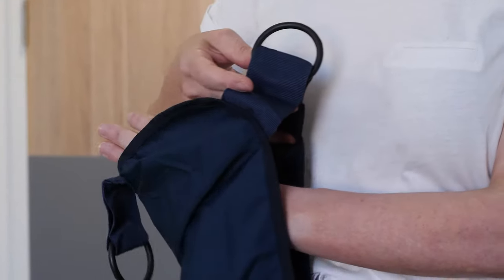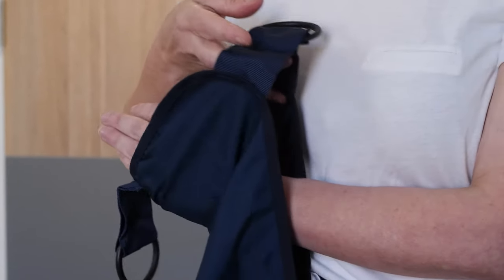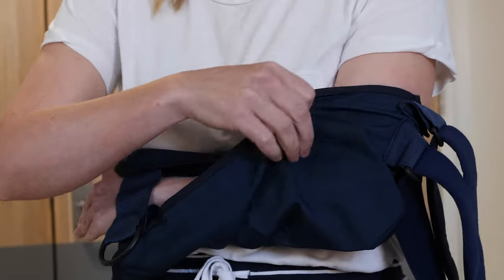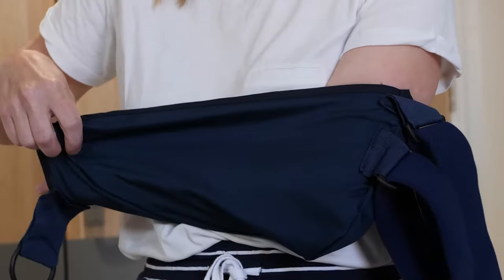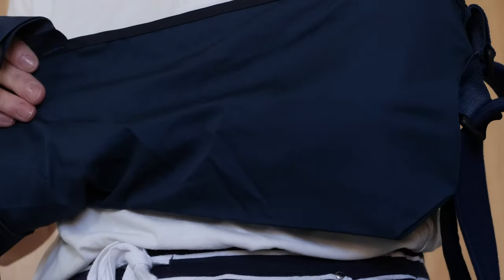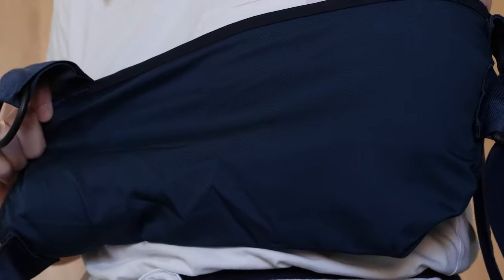Your physiotherapist will initially instruct and assist you with fitting your sling. To put on your sling, put your hand through the open end of the arm support. Then slide the arm support along your forearm and over your elbow. Holding at the open end near your wrist, gently push your elbow backwards into the corner of the arm support.